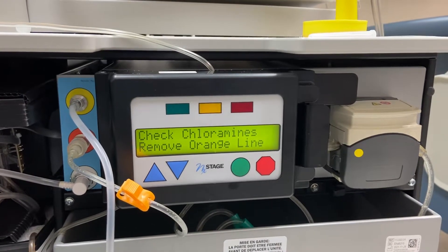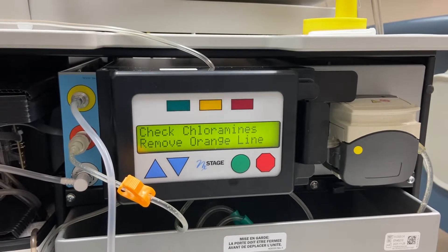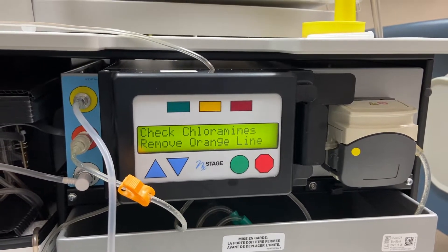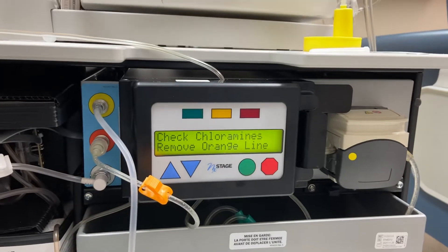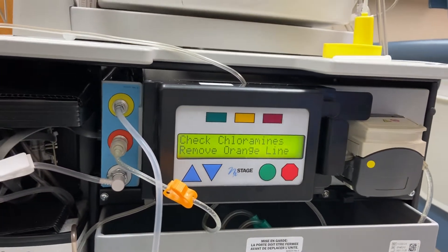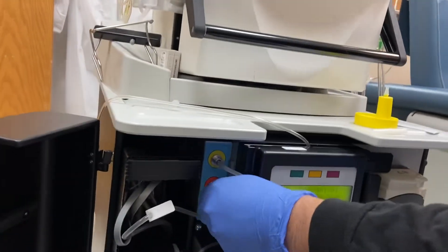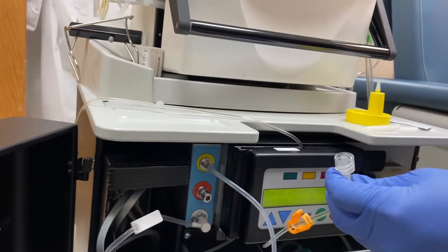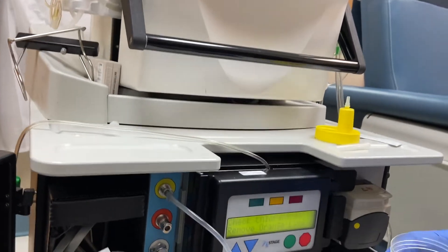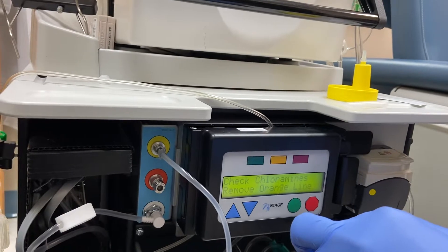Hello, this is how you check chloramines in the PureFlow NxStage machine. Go ahead Anthony, remove orange line. Point to the cup, and then now hit go.